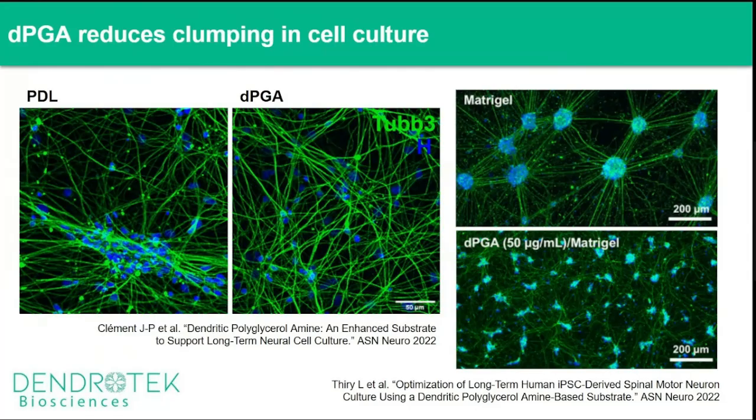On the right side, we see iPSC-derived motor neurons with matrigel alone on the top, or matrigel plus a dPGA base layer at 50 micrograms per mil. And again, we can see the reduction in the size and number of clumps, and we get sort of a more stable and adherent monolayer at the bottom. So this is really one of the clearest demonstrations that dPGA is doing something and that it's helping that adherence.